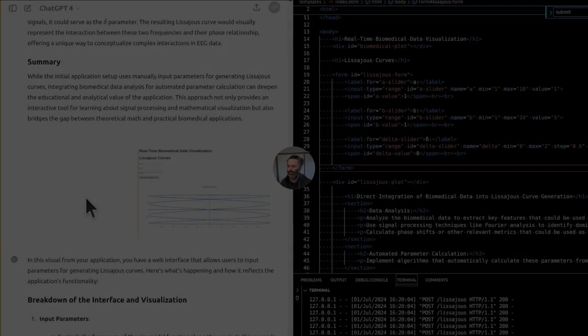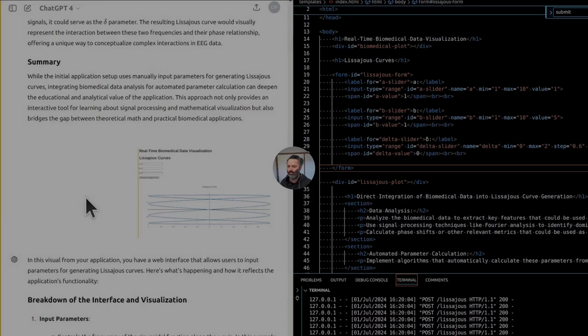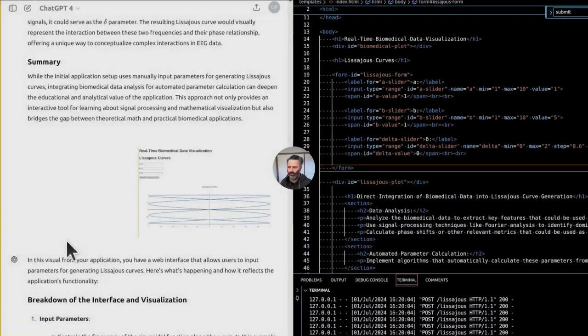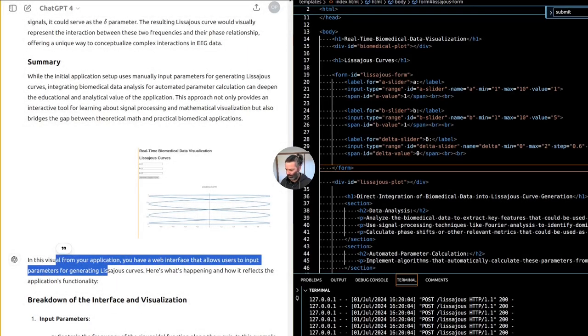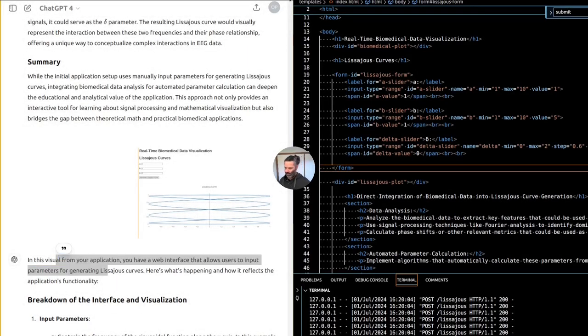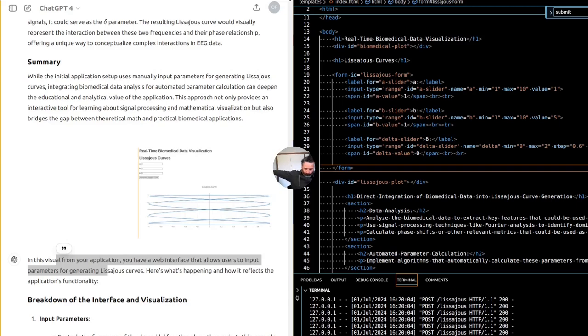In this visual from your application, you have a web interface that allows users to input parameters for generating Lissajous curves. Here's what's happening and how it reflects the application's functionality. Breakdown of the interface and visualization.